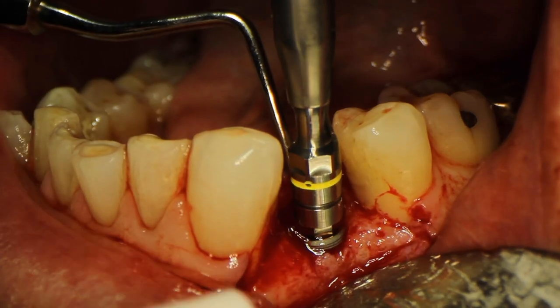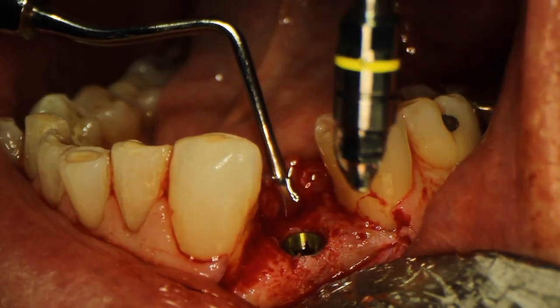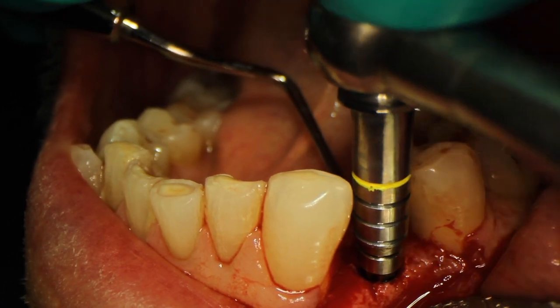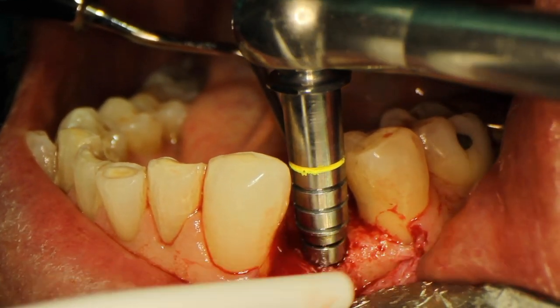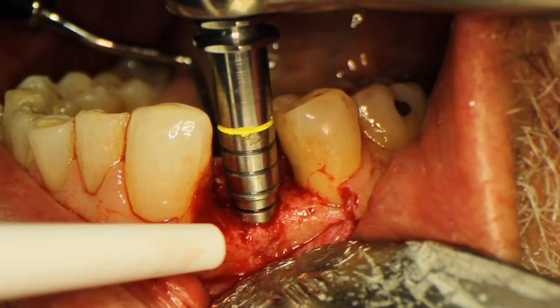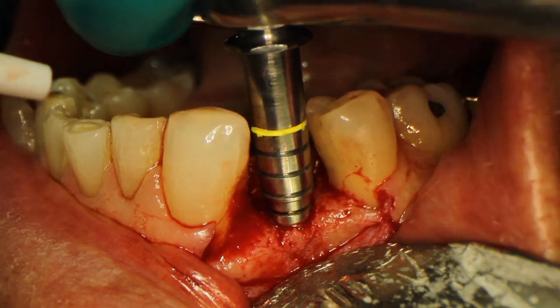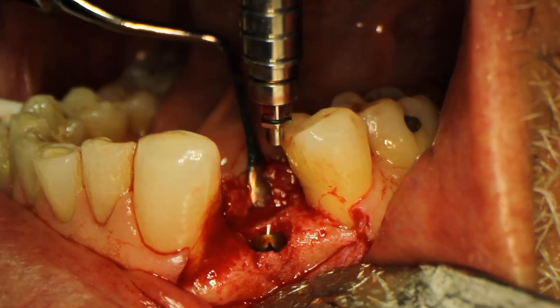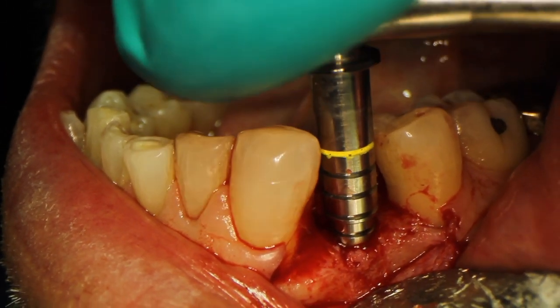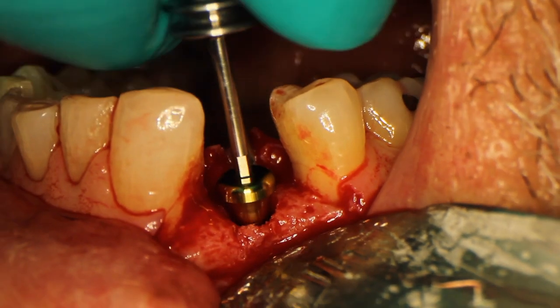I use my handpiece to do most of the work, and at the very end I can fine-tune the depth of my implant with a little manual torque wrench. I make sure that I'm about a millimeter, maybe just a little bit more, deep to the bone level. After that I'm going to put a healing abutment. I really like the convenience of Implant Direct coming with healing abutments. My only gripe is that sometimes you need a taller healing abutment and the one it came with is a little bit shorter — the tissue might grow over it — but the convenience is a huge thing.